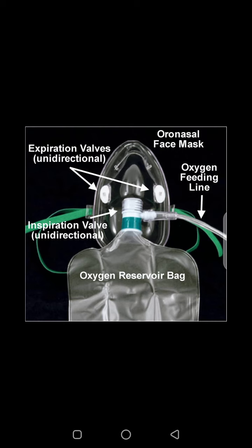That is the only situation in which the inspiratory valve opens up. And we also have the oxygen reservoir bag. This is a major distinguishing factor because a simple face mask does not have a reservoir bag. It is this reservoir bag that contains oxygen.